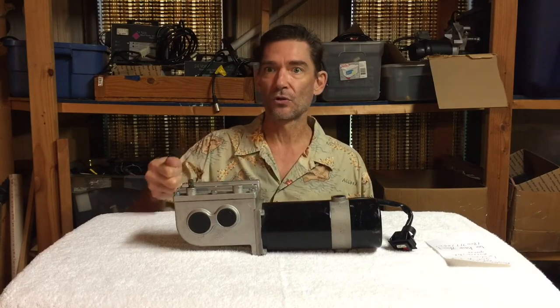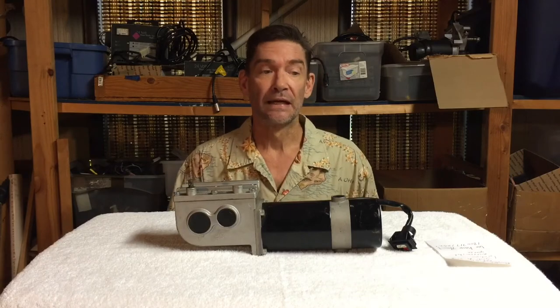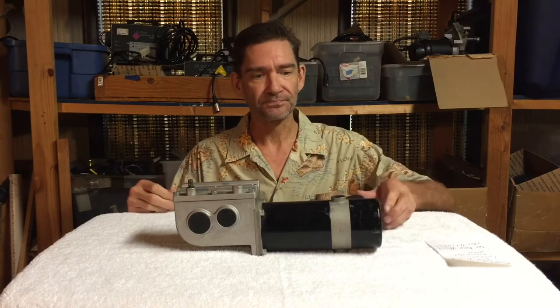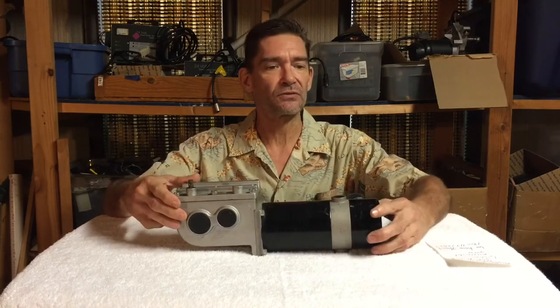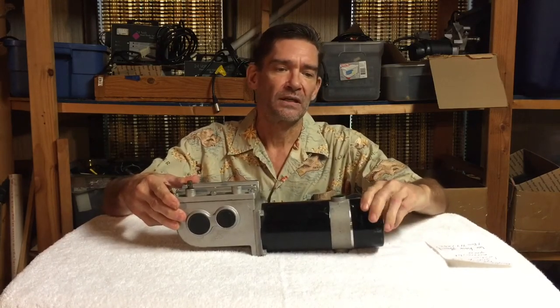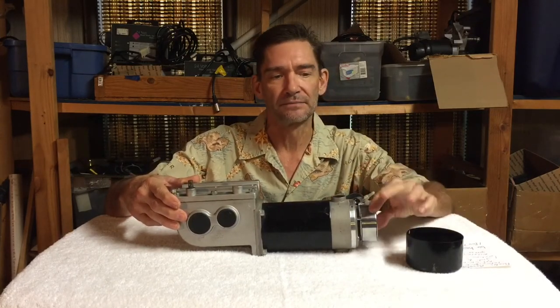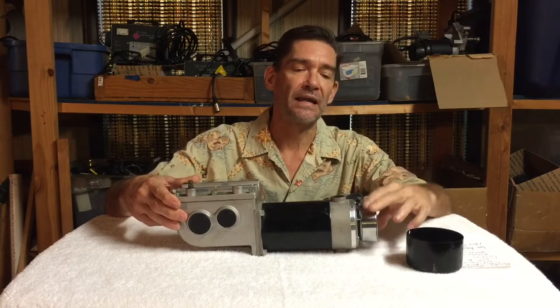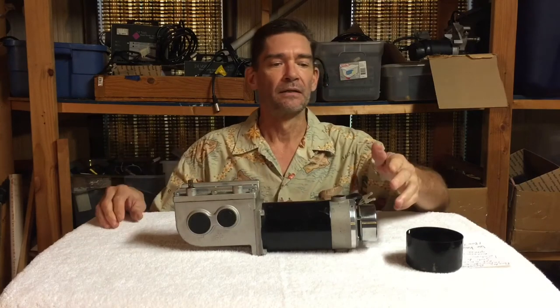Eventually the brake is just going to go bad. When it does, you'll find that you're going along fine and all of a sudden it'll slam and pull to one side — that's a brake issue. The brakes are located in the front on this pretty common style of motor. This is a solenoid brake — this is the brake right here.